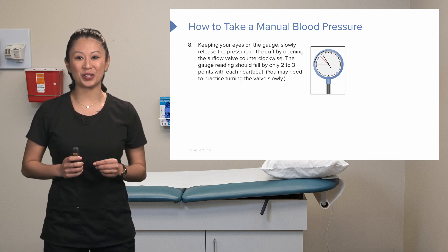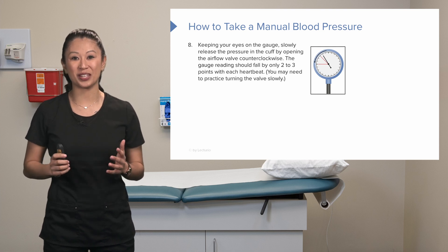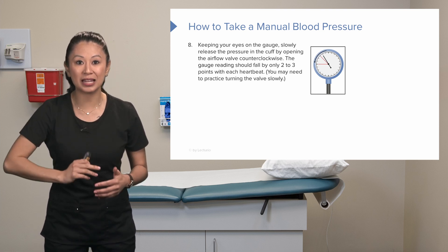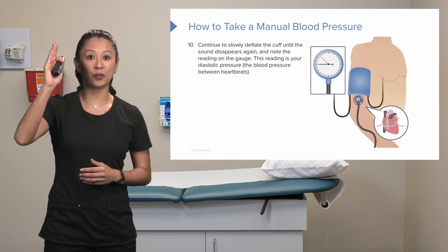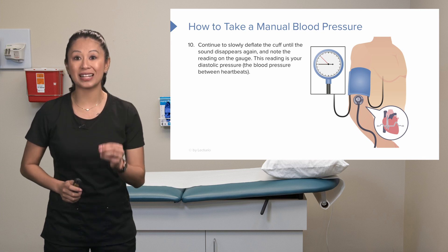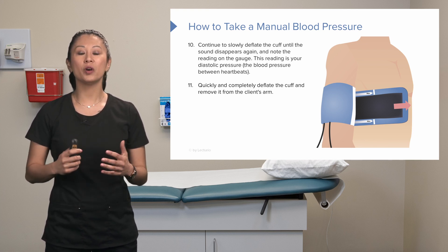This is the part nursing students must practice. If you release the valve too quickly, the gauge will drop fast and it's very hard to get an accurate reading. We want to practice the dexterity of releasing only two to three points per heartbeat. Listen carefully for the first pulse beat — that's the systolic blood pressure, our top number. Continue slowly deflating until the sound disappears again; note that reading as the diastolic blood pressure, our bottom number. Once you have the diastolic, quickly deflate and remove the cuff.